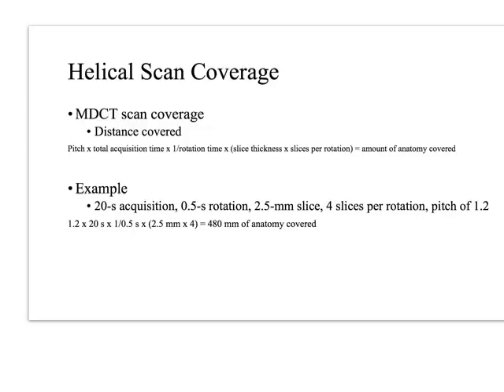As a CT tech, will you be sitting here doing this formula every day of your life? Heck no. You'll be drawing boxes on people and telling the scan to scan them because you need to get them in and out as quick as you can. But to know this is basically the heart of CT technique. This is how we improve images, how we decrease dose, etc.